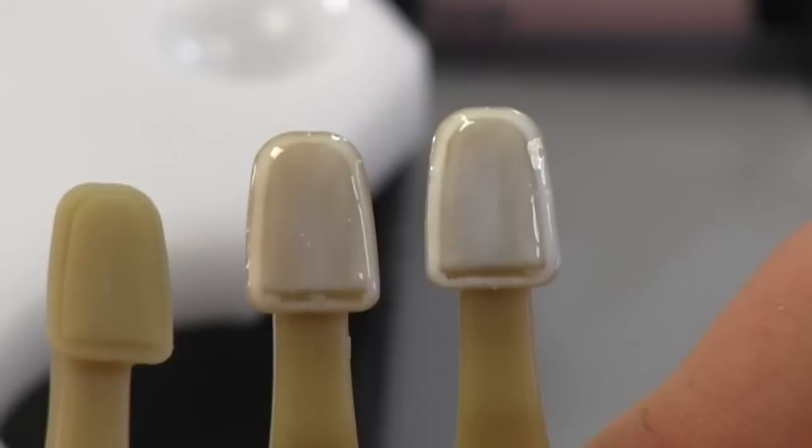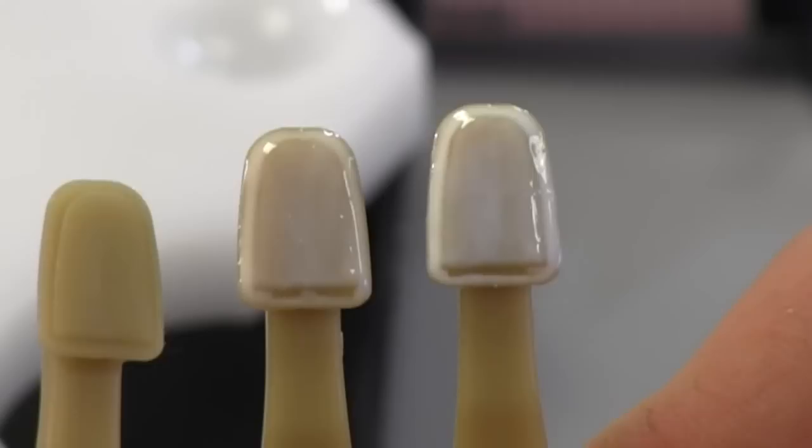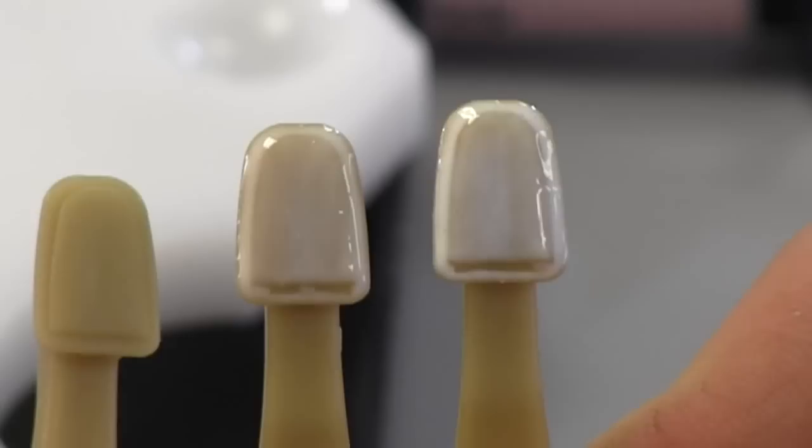On the far right, when you look at the White, you can tell just from the beginning that it looks more flat, a little bit more intense, and a little bit more opacious. So when I put my layer of composite over the top, like an A1, I'm going to see that come out sometimes a little bit brighter.